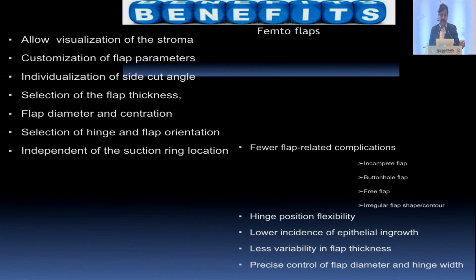There are certain essential benefits when you're doing a femtoflap. It gives you good visualization of the stroma. Once you have docked, you essentially see where you are cutting. So even if you have a suction breakdown, you can see at what level or what percentage of the cut has been done, and then you can restart the treatment. You can customize the flap parameters, I'll be talking about this. Customization means you can have a nasal or a superior hinge, and as I told, the diameter, the thickness, and the side cut angles can be customized.